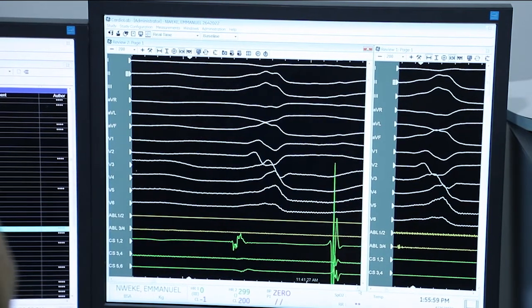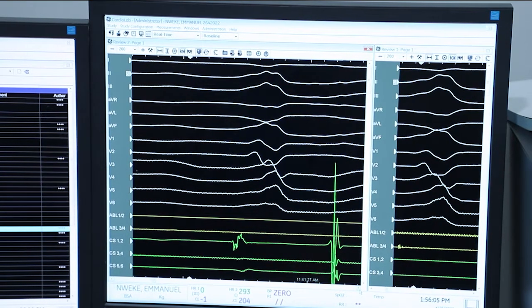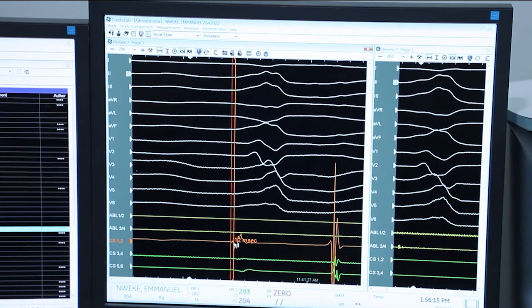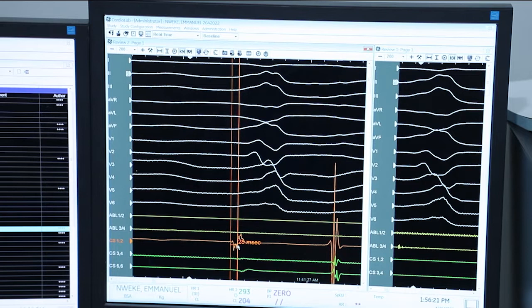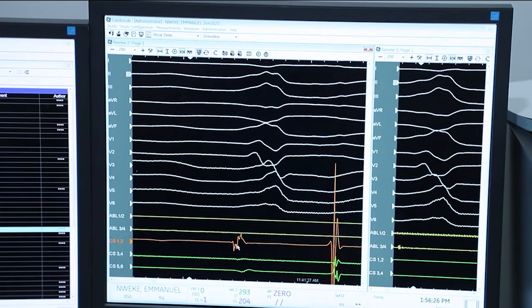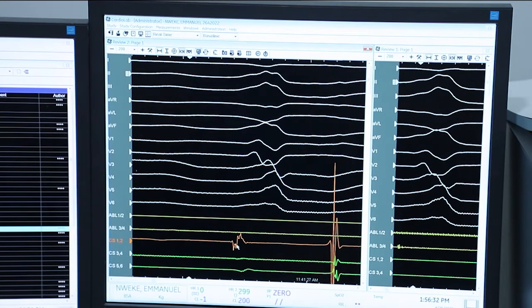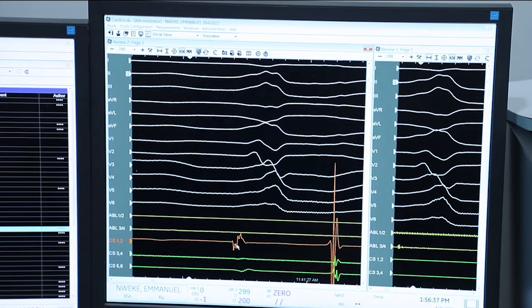We first entered a decapolar catheter inside the coronary sinus and deeply engaged inside the coronary sinus cardiac vein, and we got a very nice potential preceding the QRS complex by about 25 to 30 milliseconds from the great cardiac vein. And this emphasizes that the origin of such PVCs is from the LV summit and the basal anterior wall of the LV.